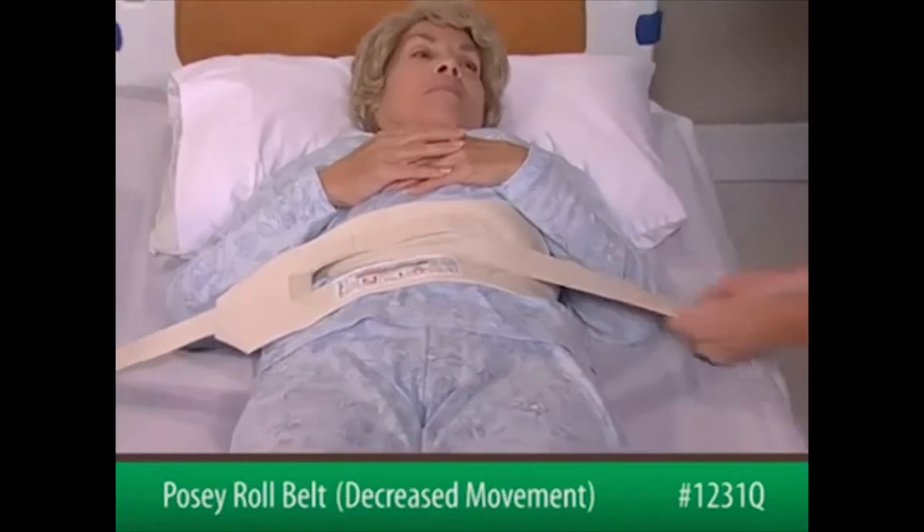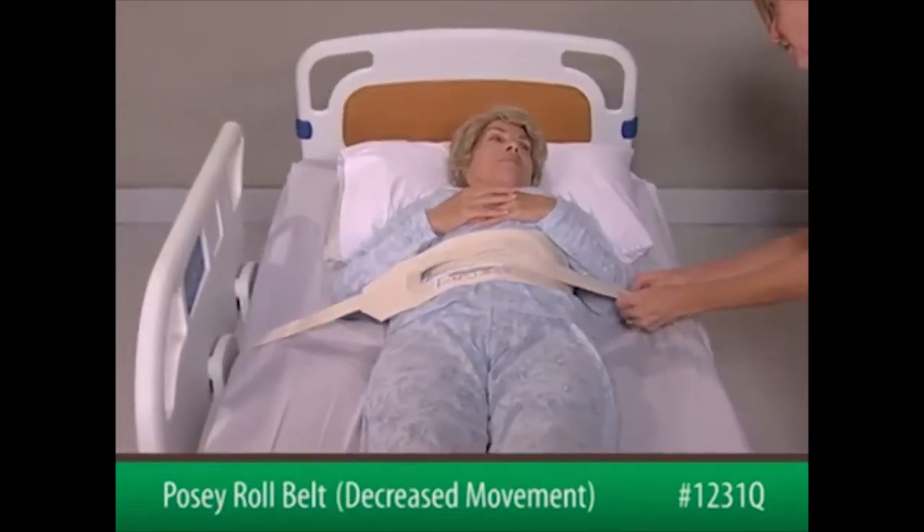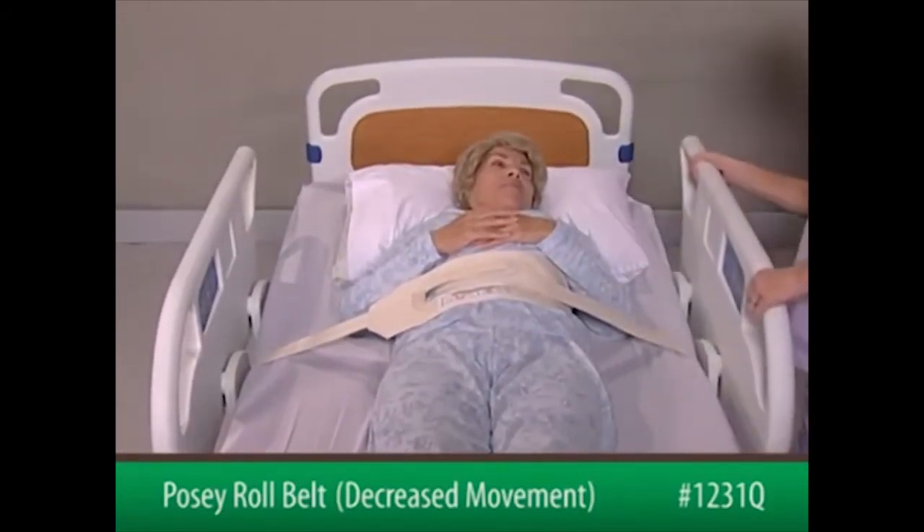The belt must be snug but not interfere with breathing. Check that the straps are secure and will not change position. Loosen or tighten if the patient pulls on them or if the bed is adjusted.